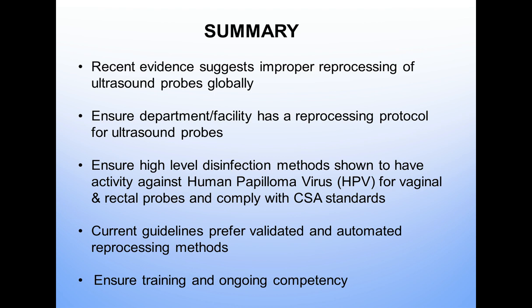Ensure your department or your facility has a reprocessing protocol for ultrasound probes and keep them up to date. Ensure that high-level disinfection methods that you use are shown and validated to have activity against the HPV, human papilloma virus, for vaginal and rectal probes, and that they comply with the CSA standards.